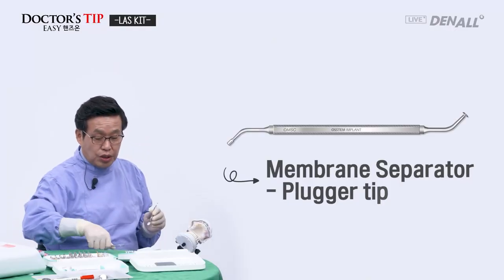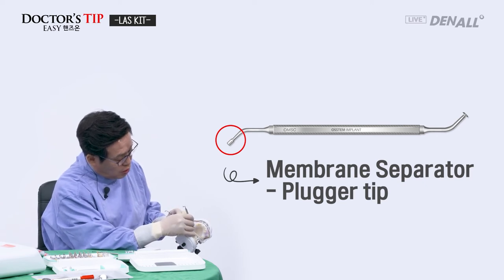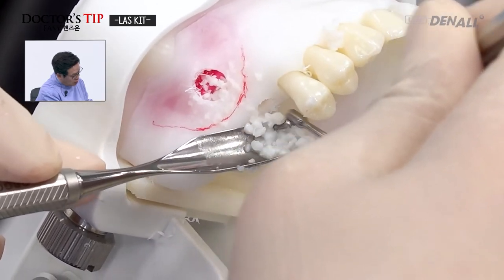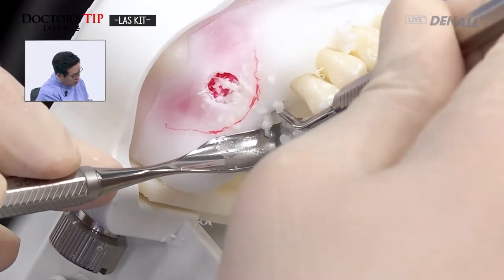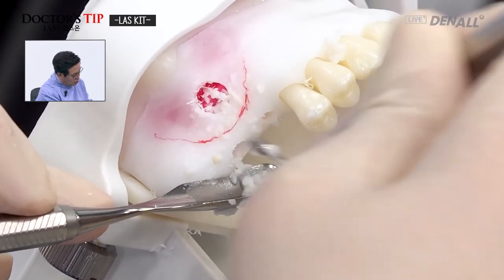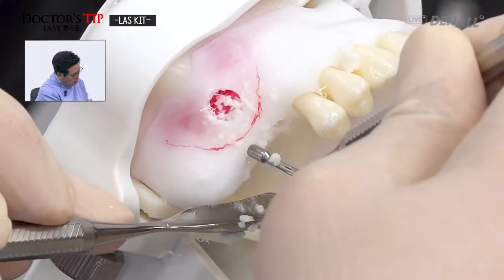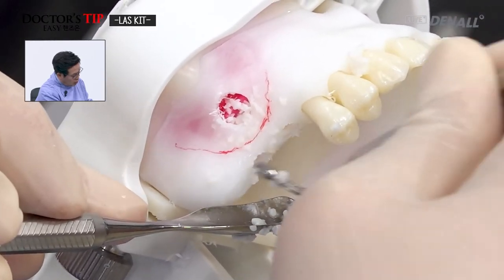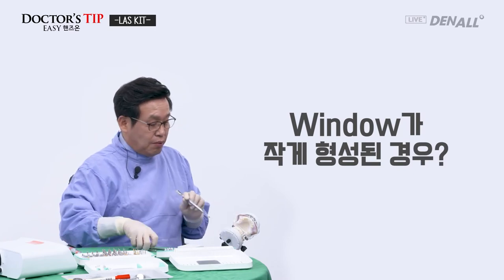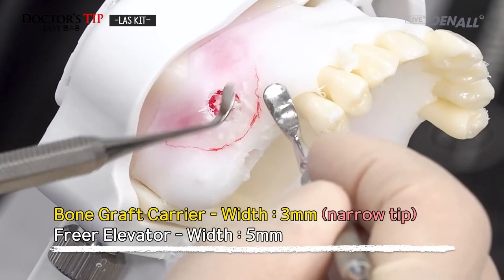And as I said before, just in case, using this plugger tip along the drilled location, along the drill hole like this, you can also do the bone grafting. So depending on position, if you are wondering whether material has gone in or not, then along the drill hole from the crestal side, you can check that the graft material goes in properly. That's important.